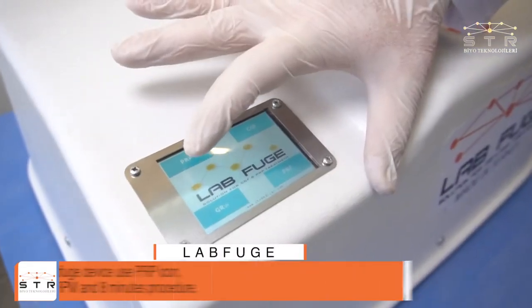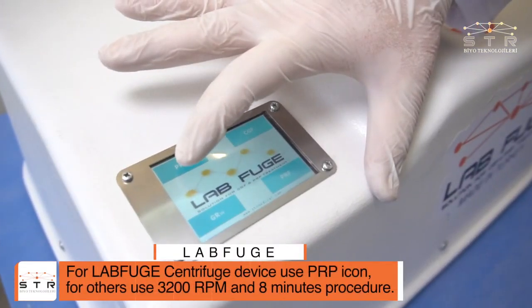For the labfuge centrifuge device, use the PRP icon. For other devices, use 3200 rpm and an 8-minute procedure.